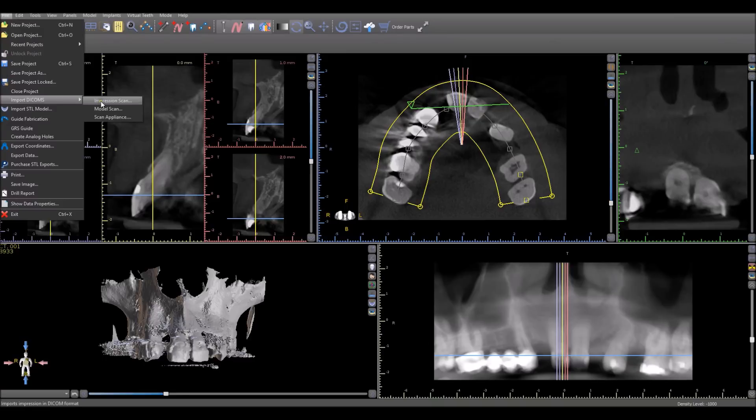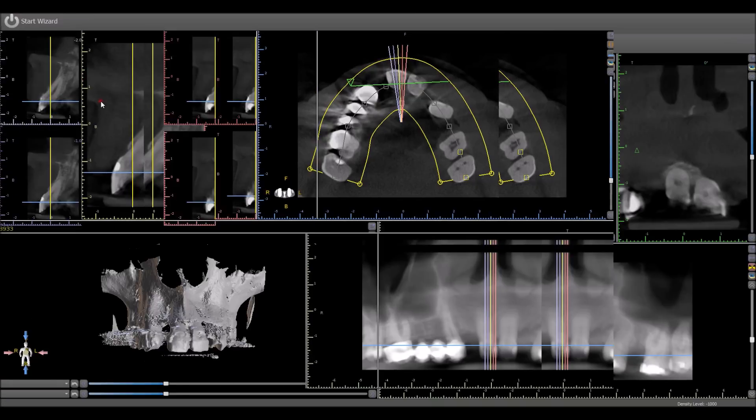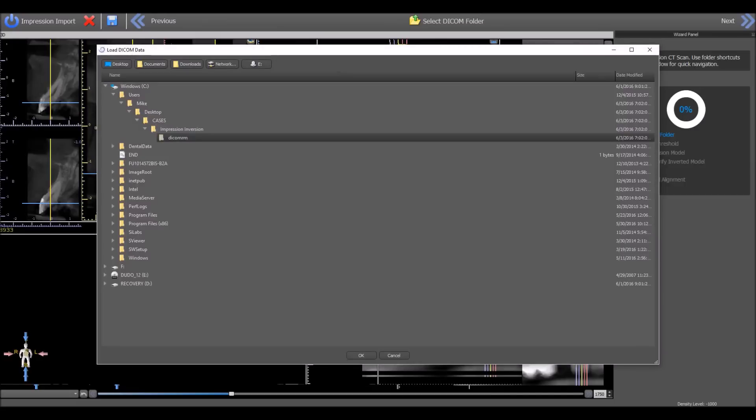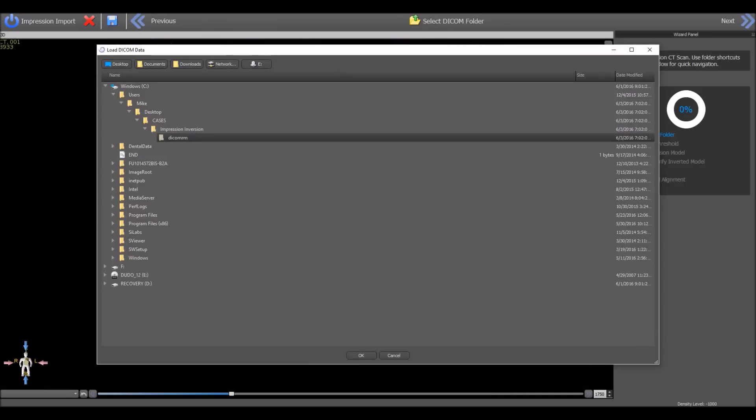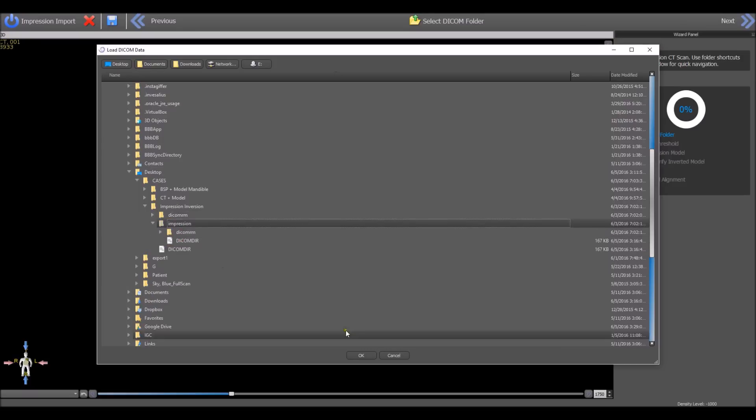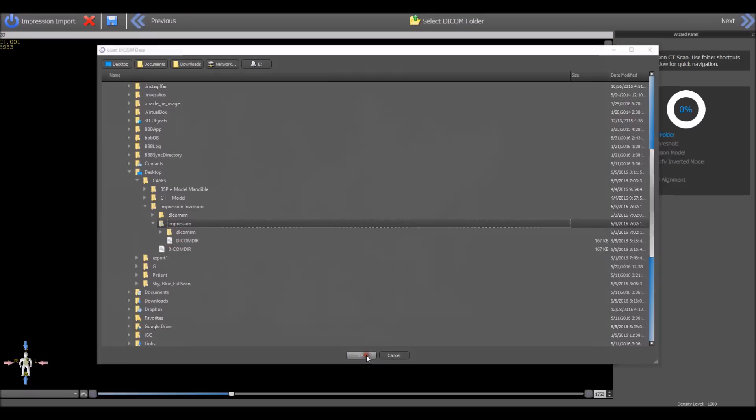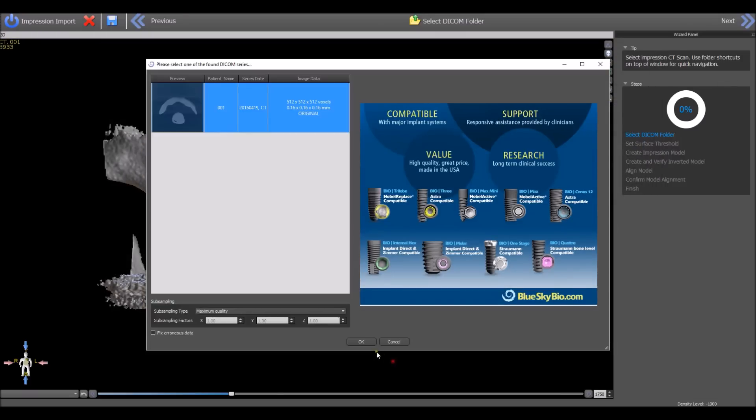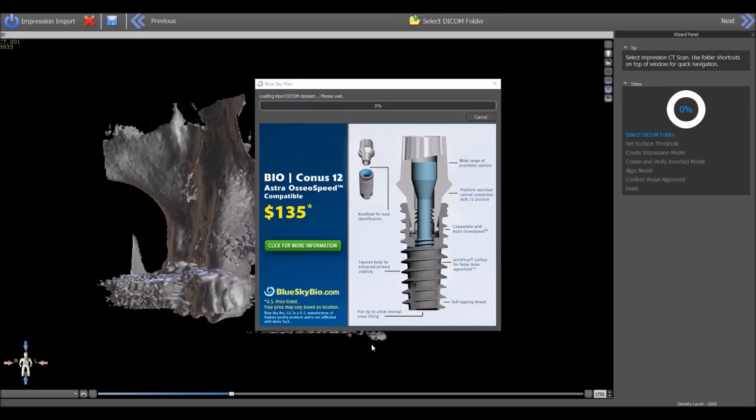For now, we are going to take a look at importing an impression scan. We navigate to the relevant folder and select the DICOMS.